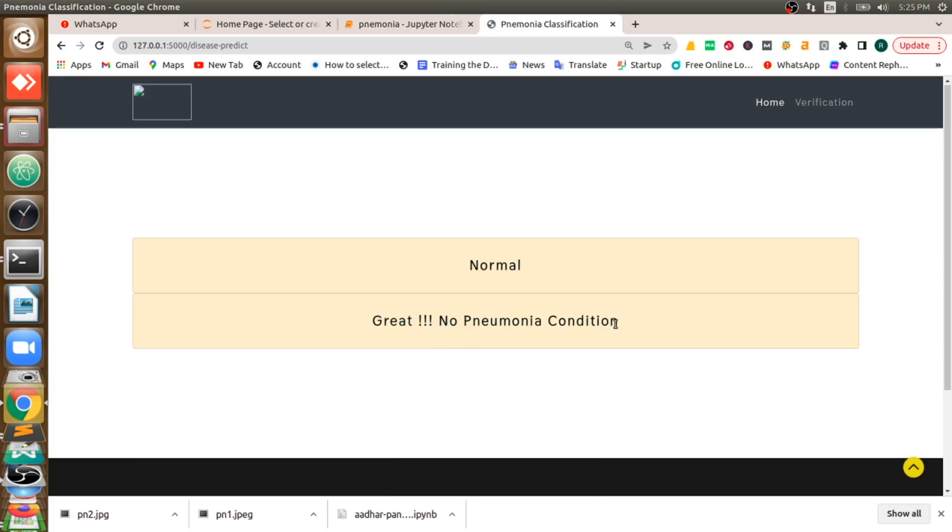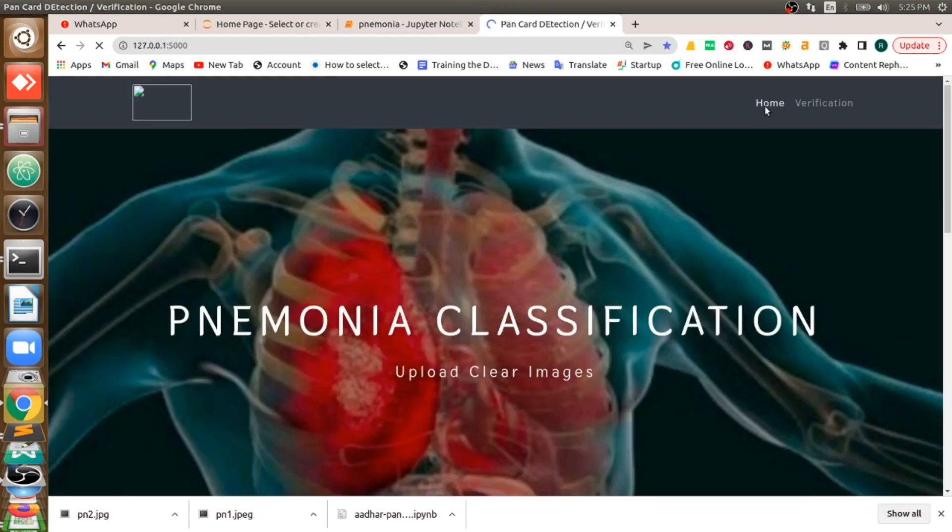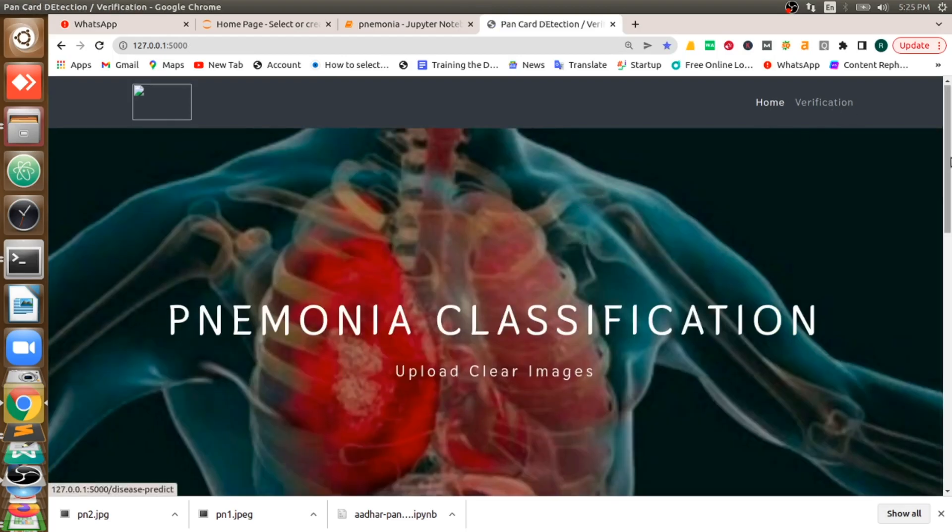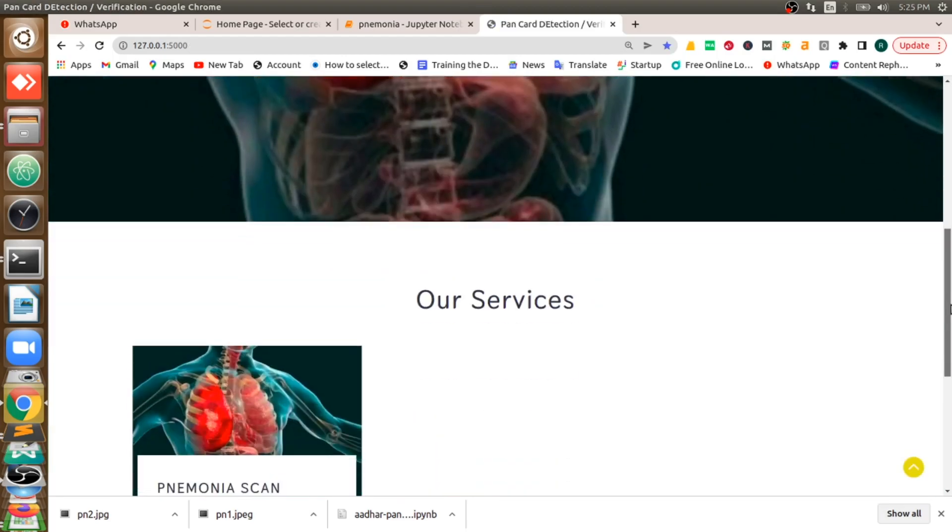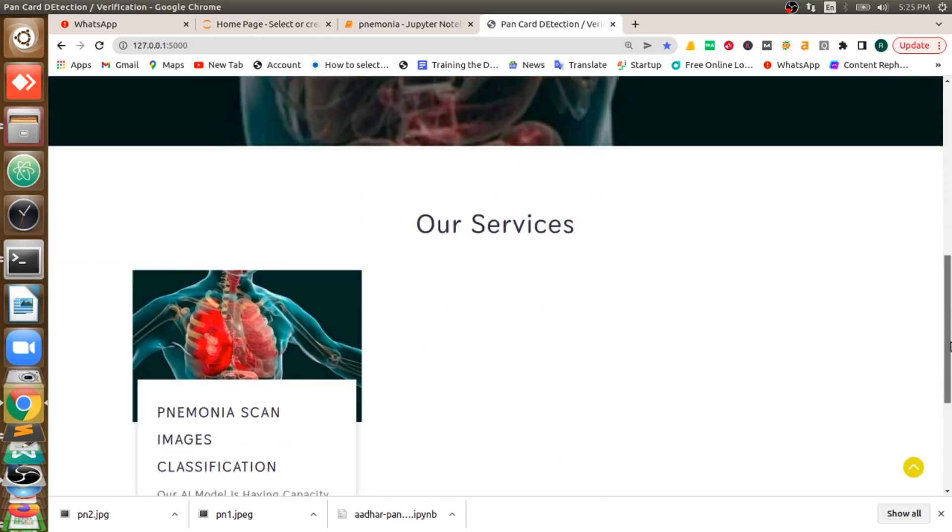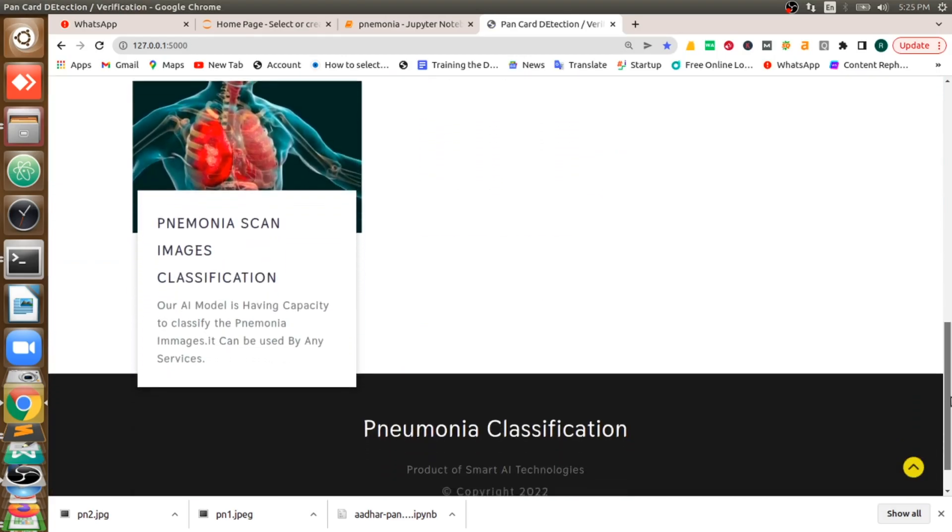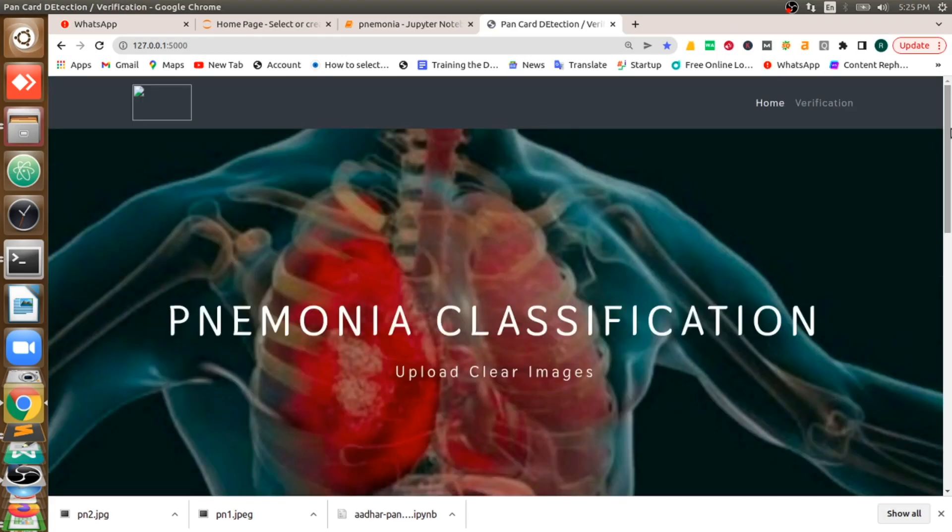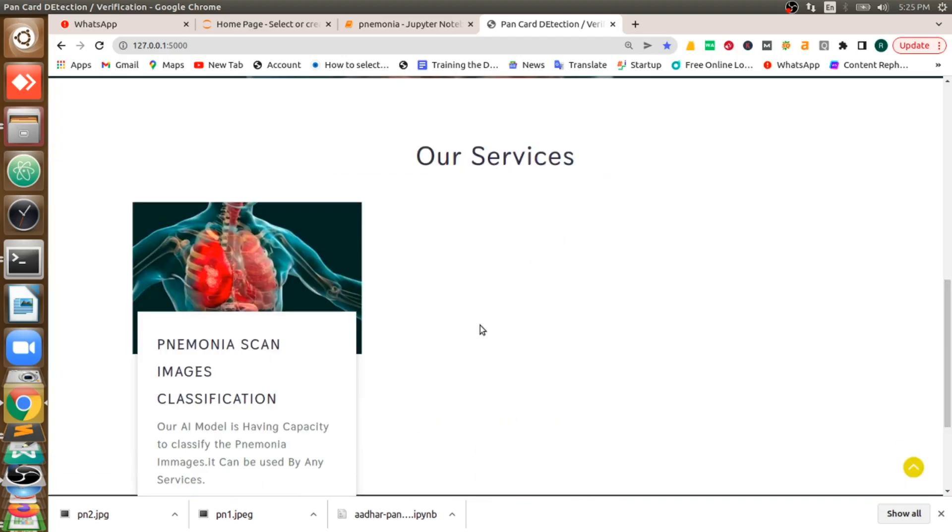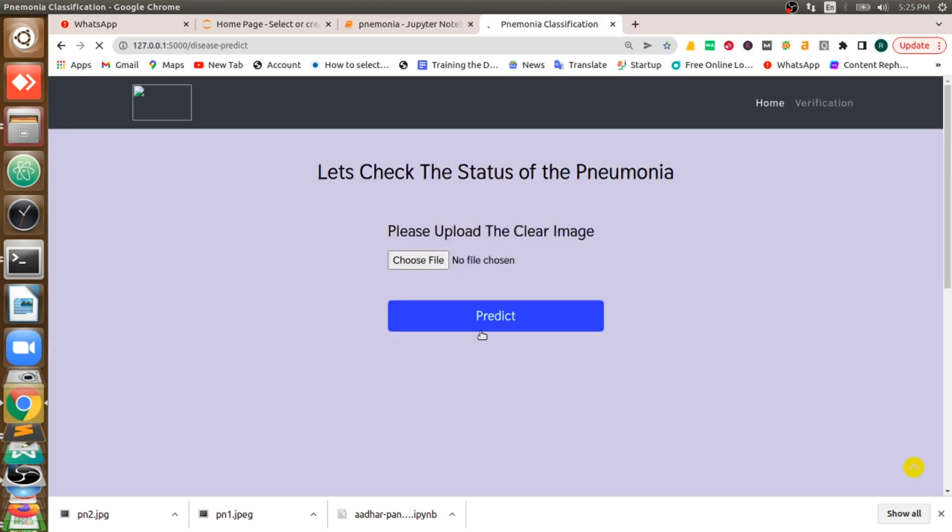So this is our entire application working. This is our home page. Here we have two ways where you can reach to the page where you can upload any pneumonia image and classify. One is verification here and another one here, pneumonia image classification. If you click on here also, you will be taken to this page where you can upload that image.